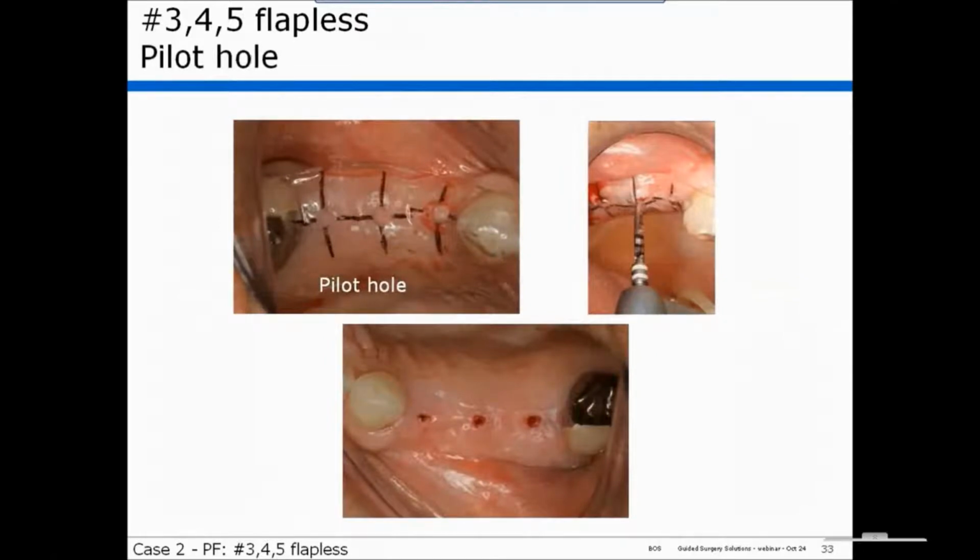In regard to the last question, you're not restricted by a tube. So if you don't like what you see, you can change it. But when you change it, you have to be aware of your cross-sectional view so that the change is compatible with the anatomy of the bone. I've changed many a trajectory when I didn't like what I saw, and they work out fine.